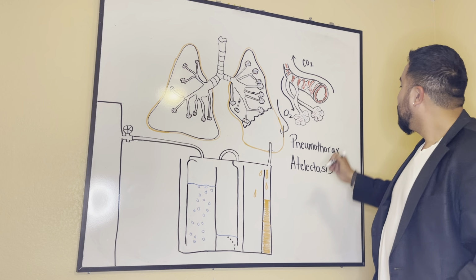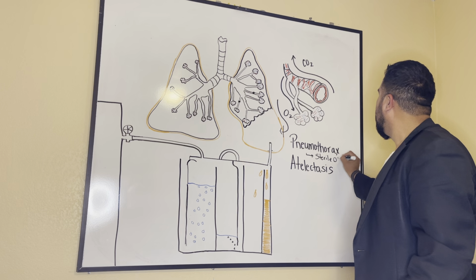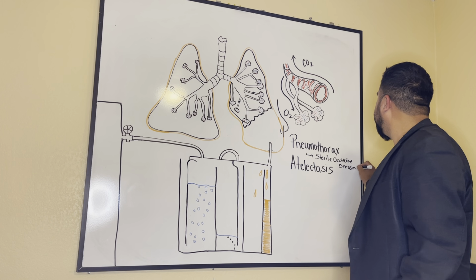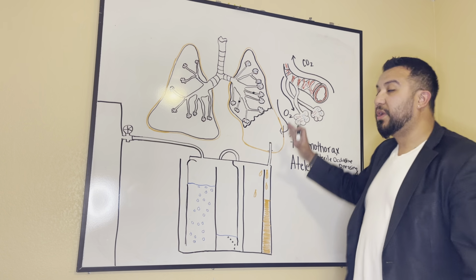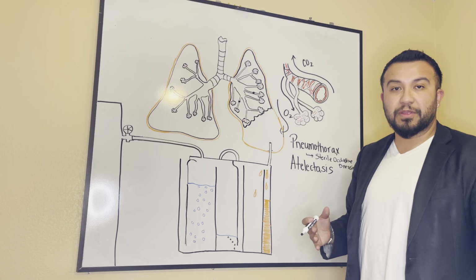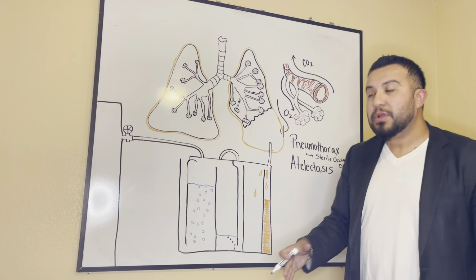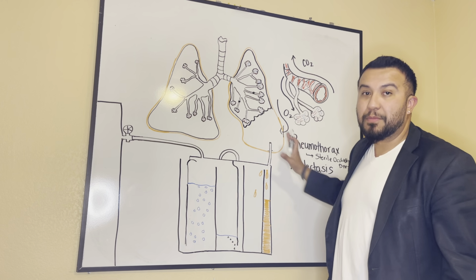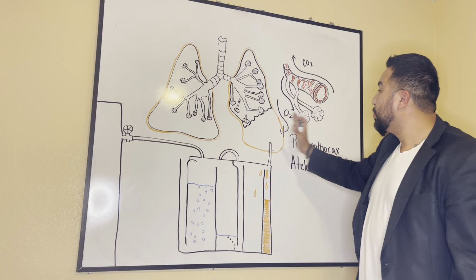How do we do that? You need a sterile occlusive dressing. Okay? You need a sterile occlusive dressing. Sterile because you don't want to present any pathogens into the opening, which is going to increase the likelihood of the patient developing an infection. It's got to be occlusive because you want it to be impermeable to the atmospheric air so it won't further collapse the lung, create more pressure that's going to further limit the expansion of the lung. So that's what you would want to do.